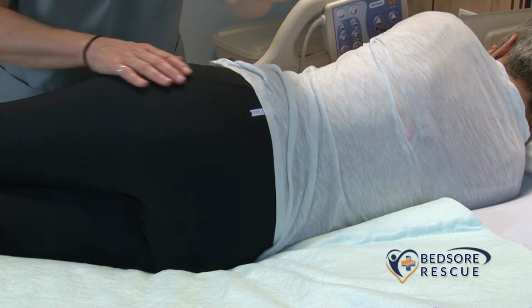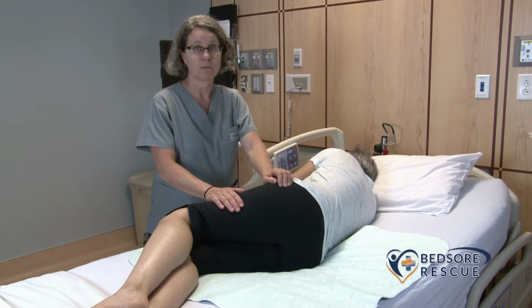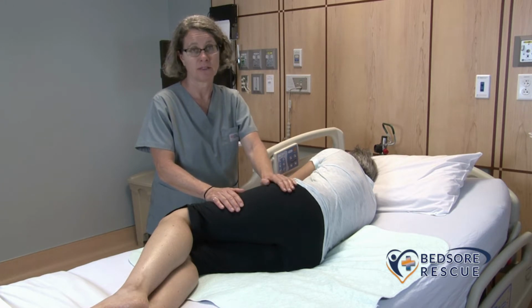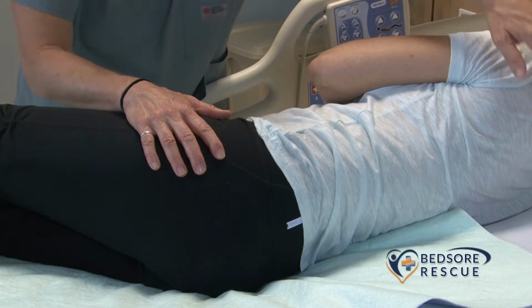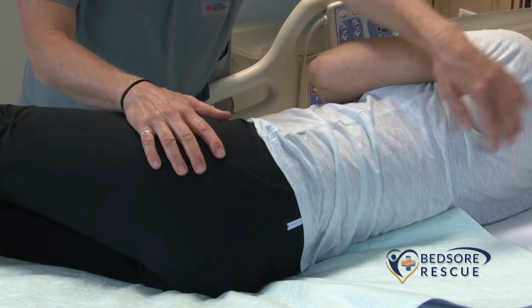The reason we want to avoid these two areas is that the skin over these areas is very close to the bone, and when sustaining long-term pressure, the circulation gets cut off and they can get bed sores, otherwise known as pressure sores, which are painful and expensive and hard to treat, so nobody wants that.